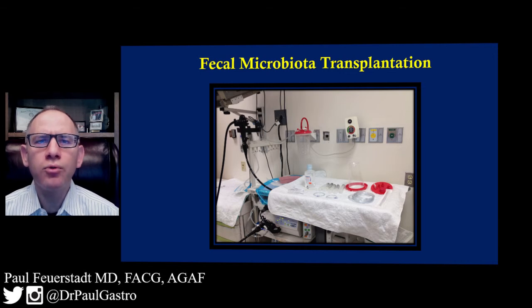That stool specimen is stored at room temperature, and ultimately when the procedure is ready, it is brought into the procedure room. At that time, we take about 100 grams of stool, we mix it with 500 milliliters of normal saline, and blenderize it. It's blenderized for approximately 3 to 4 minutes, and then there is a sieve process where we remove the fibrous contents of the liquid, isolating the bacteria and the other elements from the stool that we are focused on most that will help the recipient the most. This liquid matter is then drawn up into 5 or 6 60 milliliter syringes.